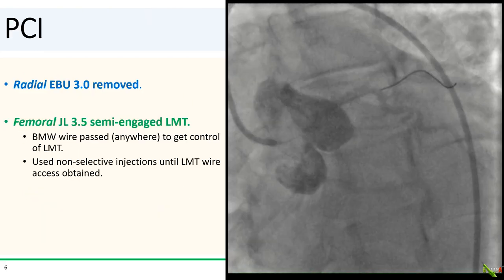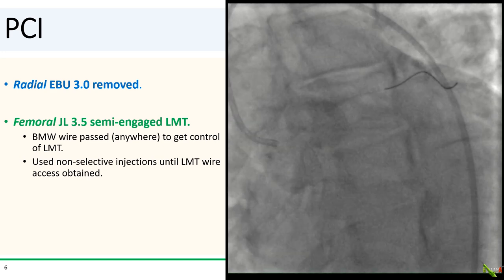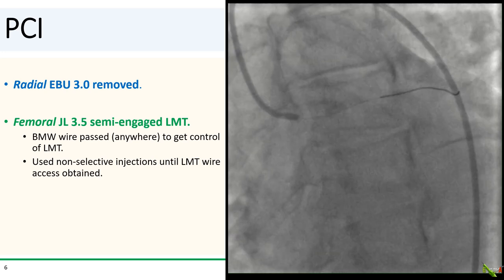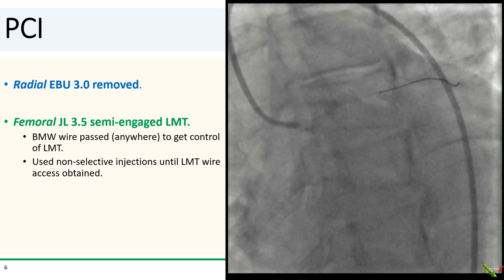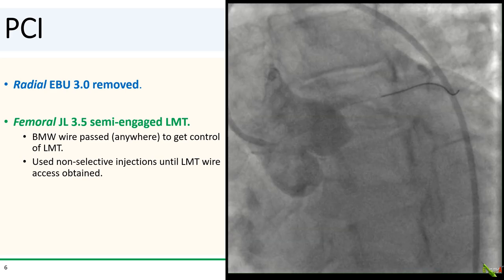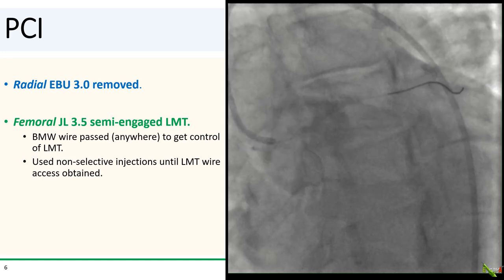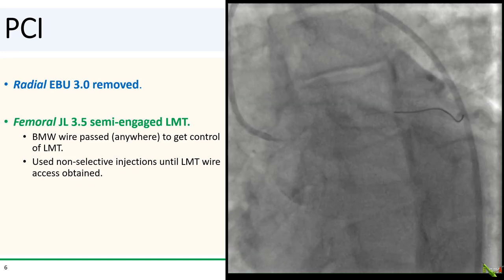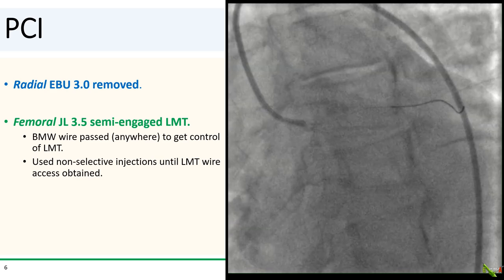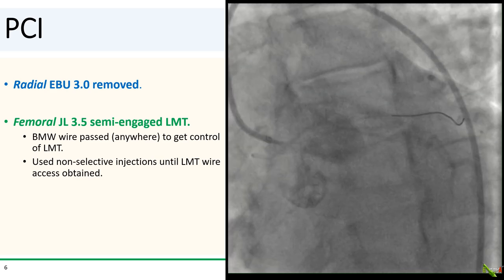In this case, the radial EBU 3.0 was removed. And because it was so difficult to engage the left main from the radial approach, the left main was then gently re-engaged with a JL guide, but from a femoral approach. A BMW wire was then quickly passed to get control of the left main. Until there was wire access to the left main, non-selective injections were used to reduce the possibility of further enlarging the false lumen.